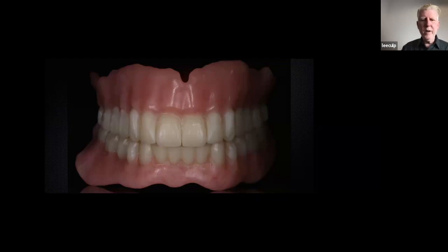So back to our denture, we've milled it out, we've got it all bonded together. Now I'm just going to add some composite to the front. I'm going to lightly blast the areas that I'm going to add. It's not a lot of composite. I'm just adding composite to give me that natural look of tissue instead of just the base that we see here.